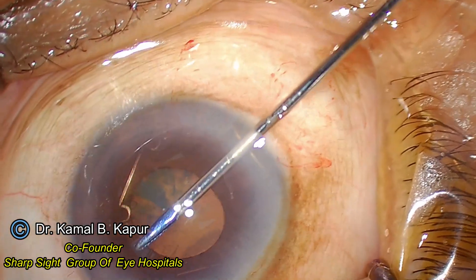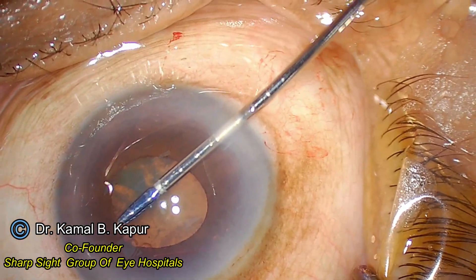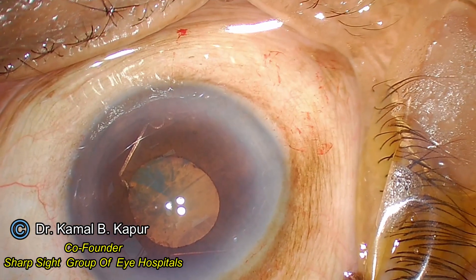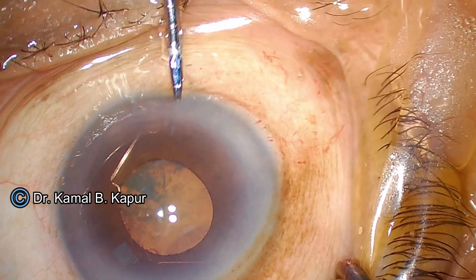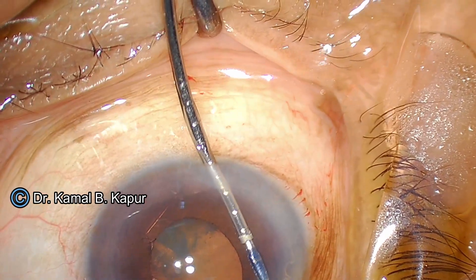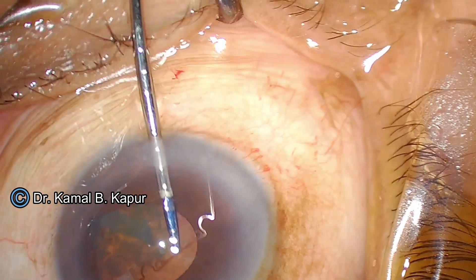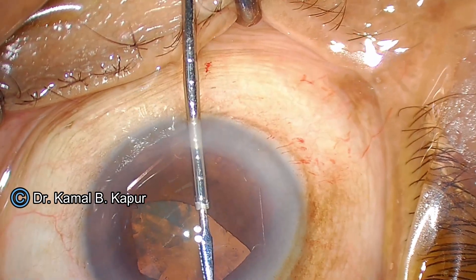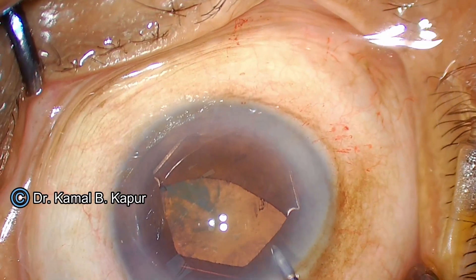You will notice me implanting the B-hex pupil expander. I prefer holding the nub or the knuckle of the expander, which gives me better control over the expansion ring and helps me maneuver the ring one step at a time at two inclination spots.